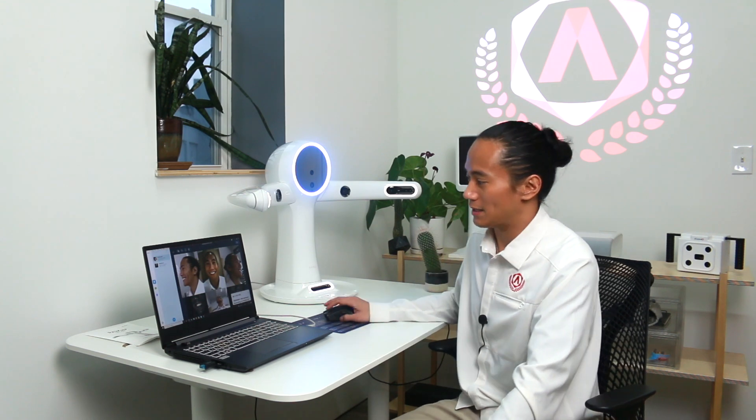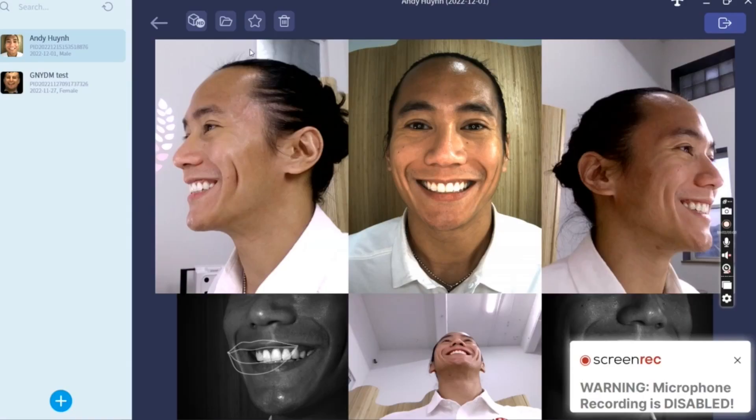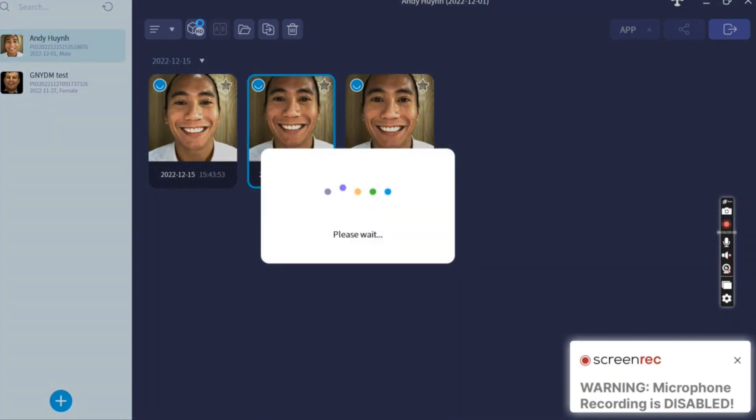Once the patient's pictures have been recorded, we're going to build those pictures into the 3D model. That's easily done by just clicking the HD builder in the top left-hand corner of the screen.